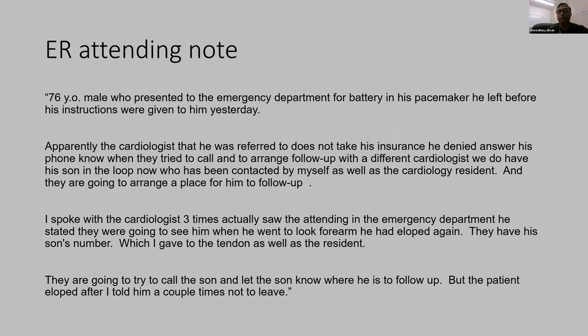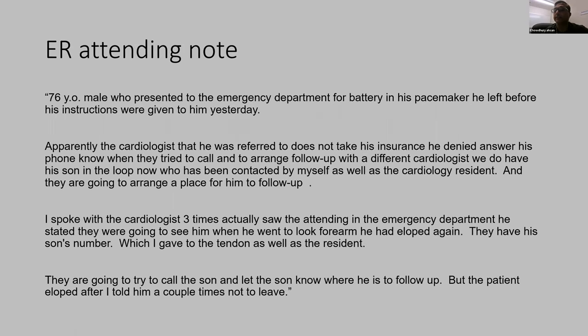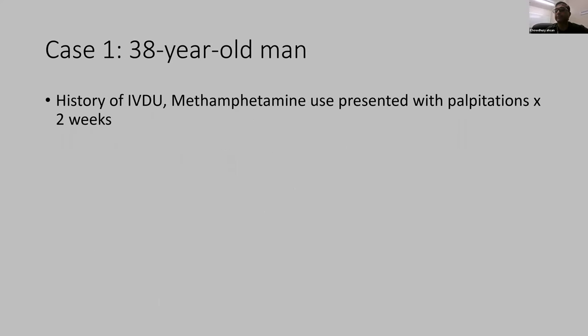And I just wanted to mention this. In the EKG report, sometimes they say ERI and then EOS when they interrogate. But I don't know whether our audience is clear with this, that is elective replacement interval versus the end of service. Rafique Bhai, do you have any comment? Because sometimes people panic with the ERI, they think, oh, the pacemaker is gone, and then they admit the patient and prolong hospitalization, which you can do as an outpatient.